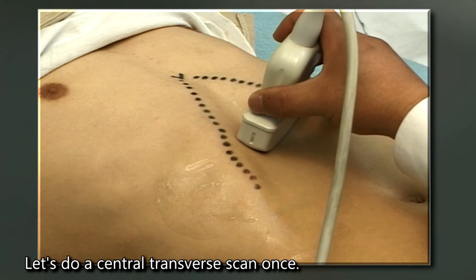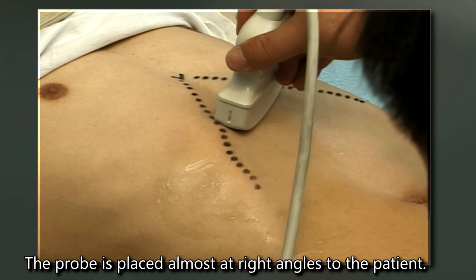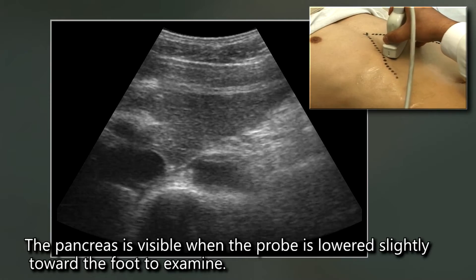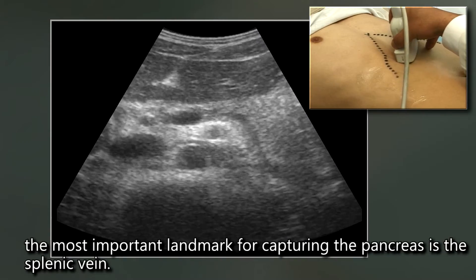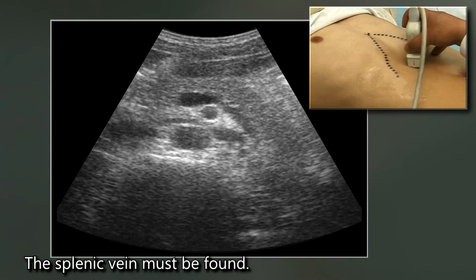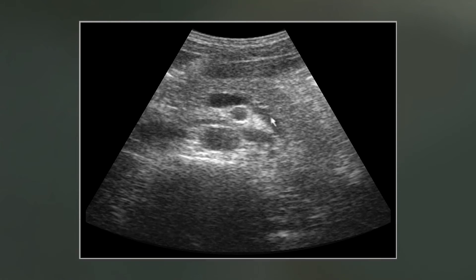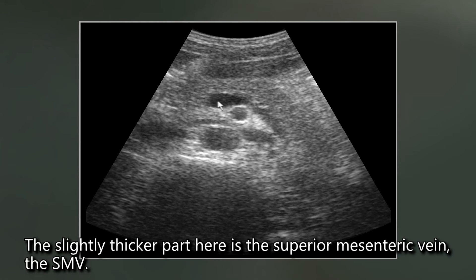Let's do a central transverse scan once. Probe direction at 8 o'clock. The probe is placed almost at right angles to the patient. The pancreas is visible when the probe is lowered slightly toward the foot. Stick your belly out a little. The most important landmark for capturing the pancreas is the splenic vein — the splenic vein must be found. The cystic tubular structure continuing here is the splenic vein. The slightly thicker part here is the superior mesenteric vein, the SMV.